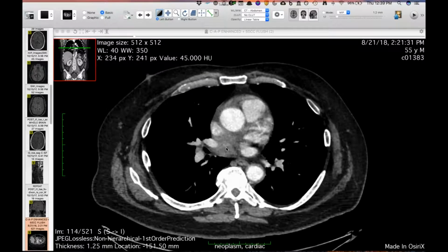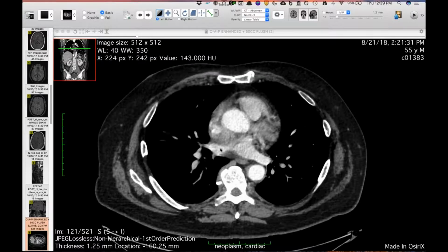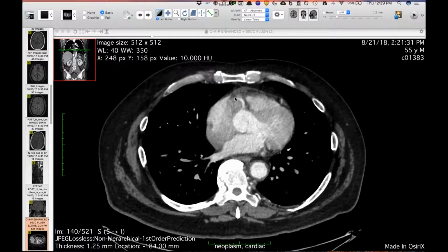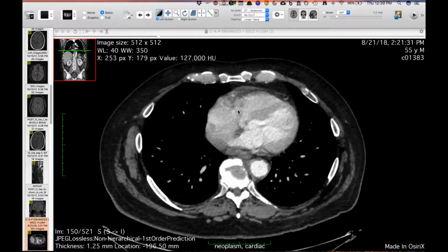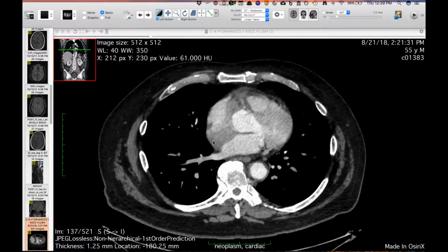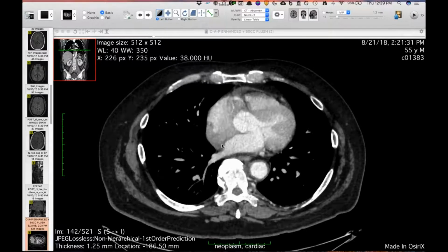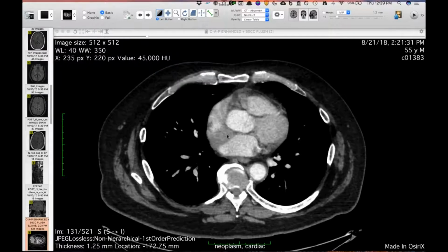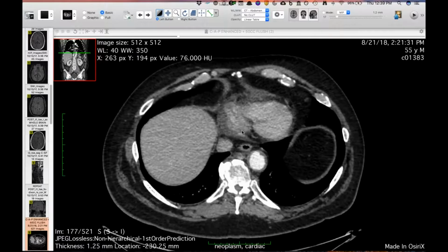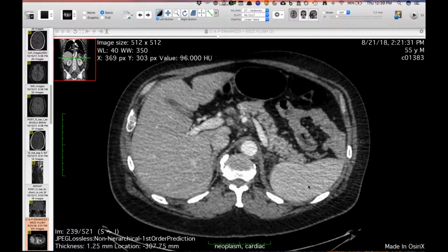And you can see, I got excited very quickly when I saw this soft tissue that's infiltrating in the pericardial space. It insinuates into the interatrial septum. A little bit of soft tissue probably encasing the right coronary artery as well. You can see it along the posterior wall of the right atrium. So by this point, I was like, well, this would be a very good look for lymphoma, and just talking about the difference between this and lipomatous hypertrophy of the interatrial septum. And then I said, let's go look at the spleen and see what's going on. And the spleen looked okay.